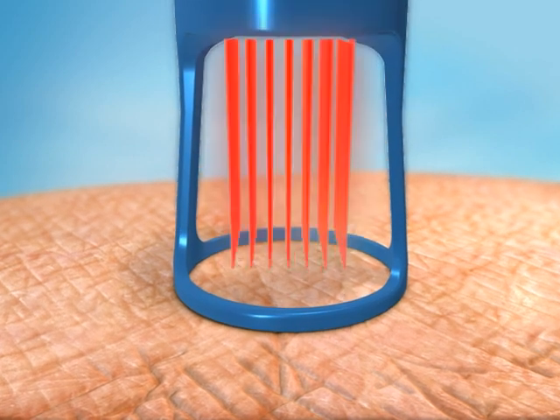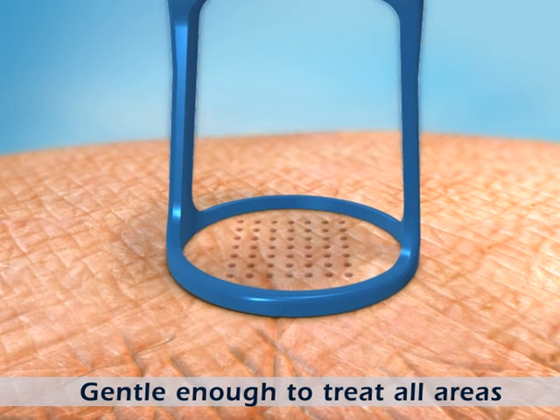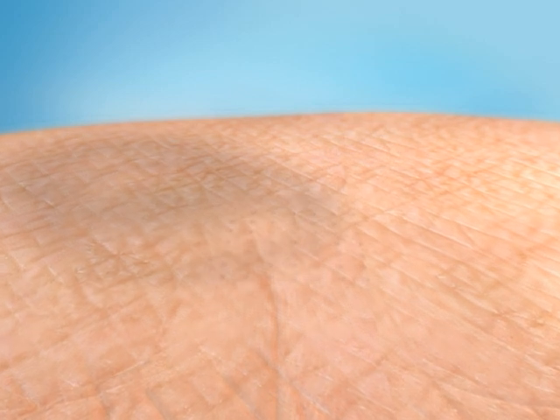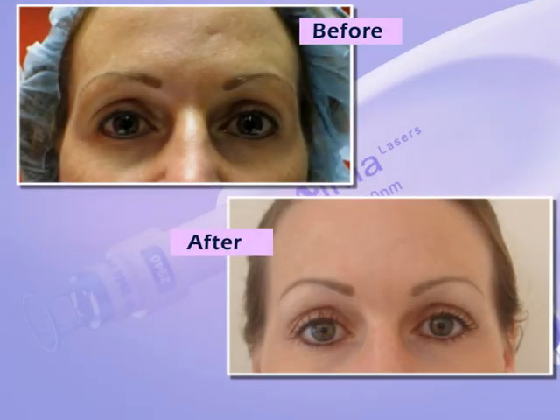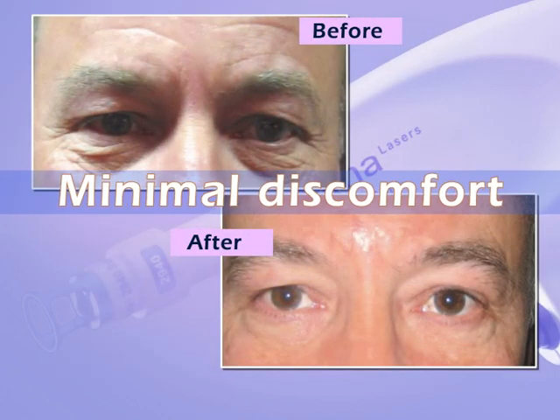Since only a fraction of the treatment area is affected, delicate skin areas such as the neck, chest, and hands can be easily treated. The minimal depth of penetration of the pixel multiple beams results in minimal discomfort to the patient.